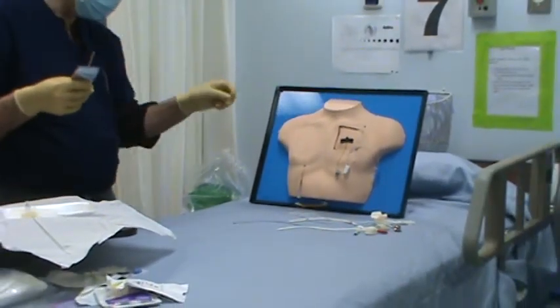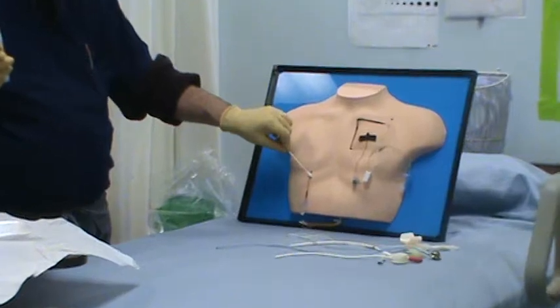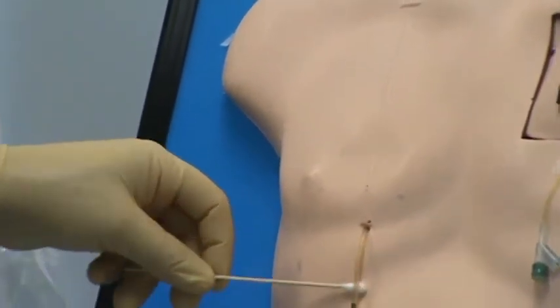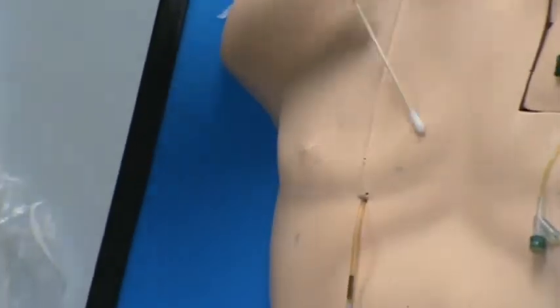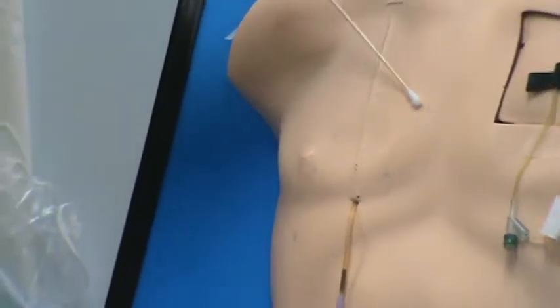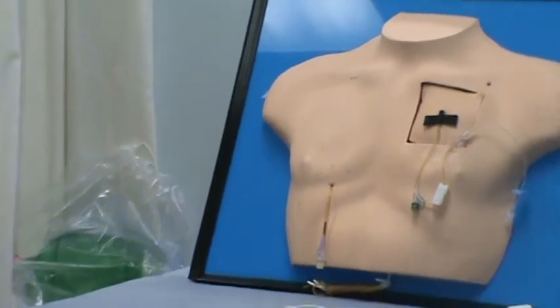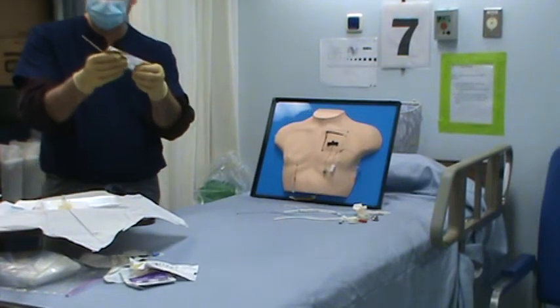Pull out a second one. Once again, brand new, so I'm going to start in the center, work my way around, over and under. Little bit of a bigger circle here, working my way out. And a lot of times patients want to talk to you. I'm like, please don't talk to me during this because we're spreading germs when you talk. I'd rather just get this done safely. And a lot of times patients go, hey, I appreciate that.